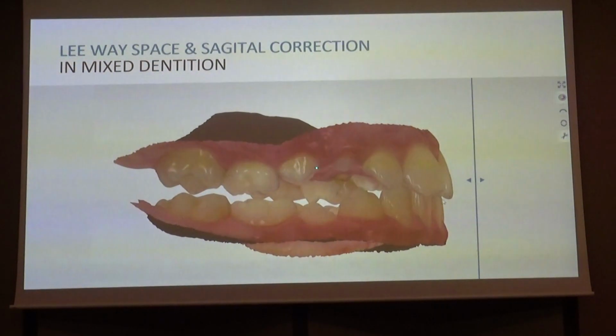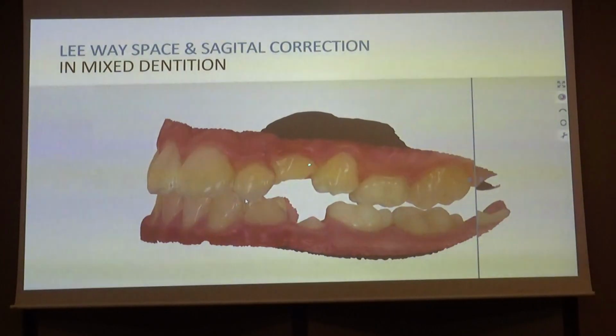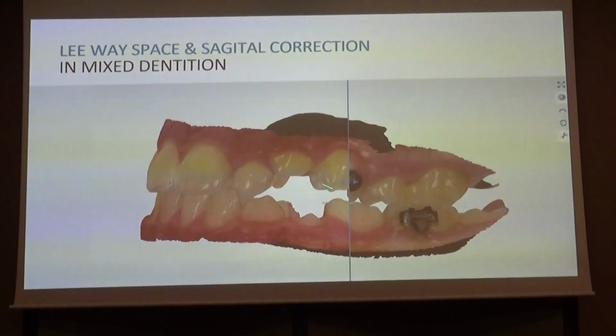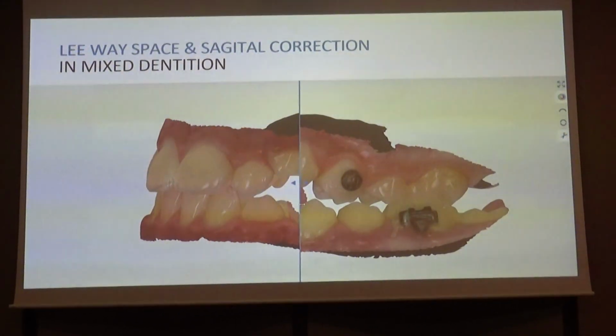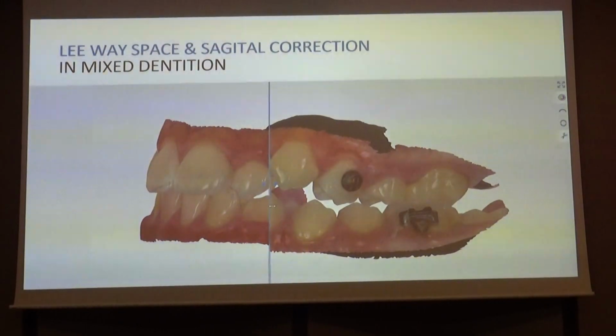Combination of elastics plus the digital planning of the tooth movement.